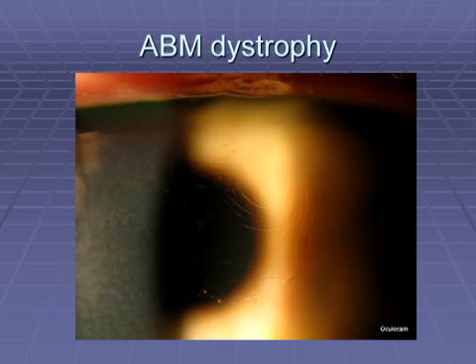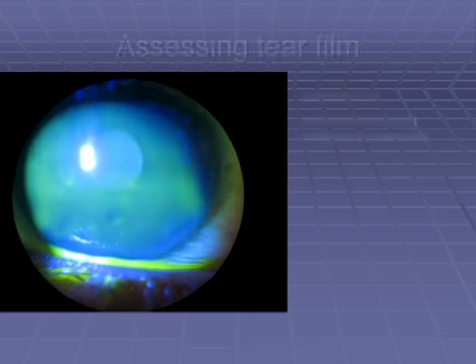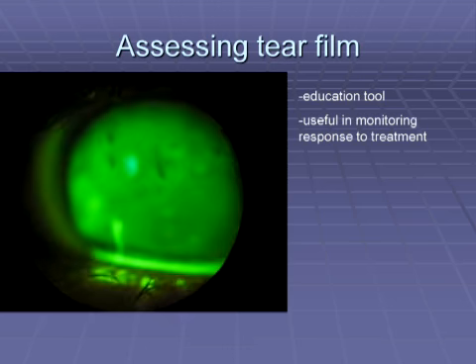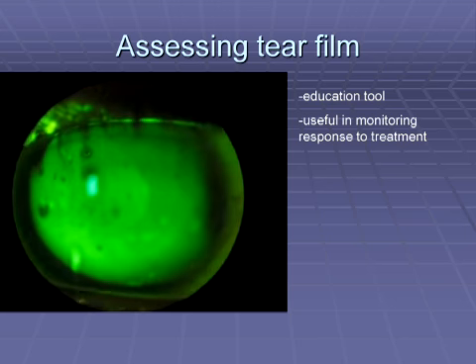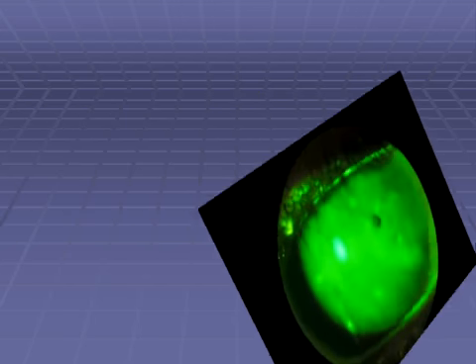erosions occurring almost weekly. The final video clip was created for a patient with complaints of intermittent blurred vision who doubted the diagnosis of dry eye as the source of her frustration. The video made further explanation unnecessary, assured compliance, and made it simple to gauge response to treatment.